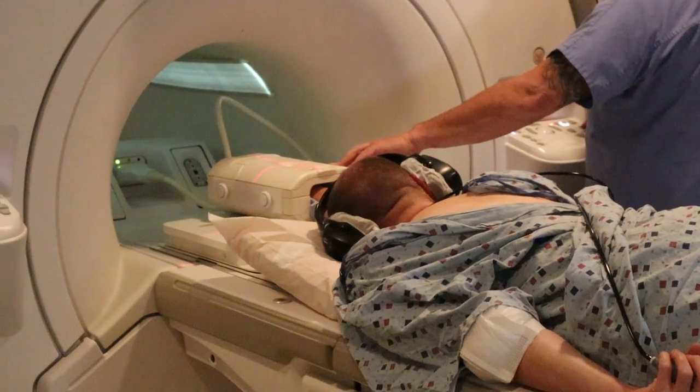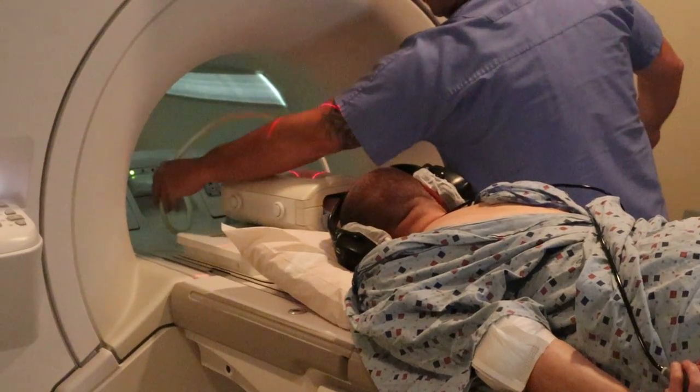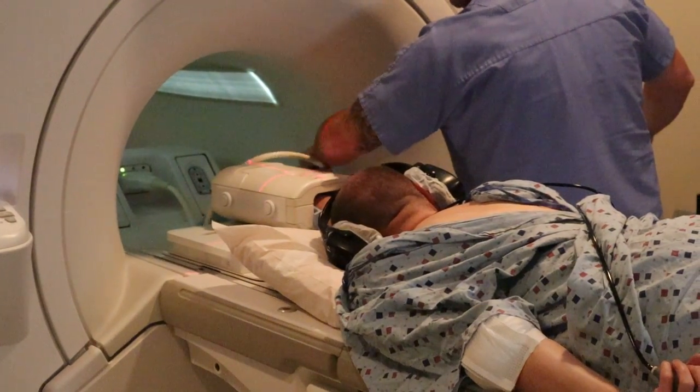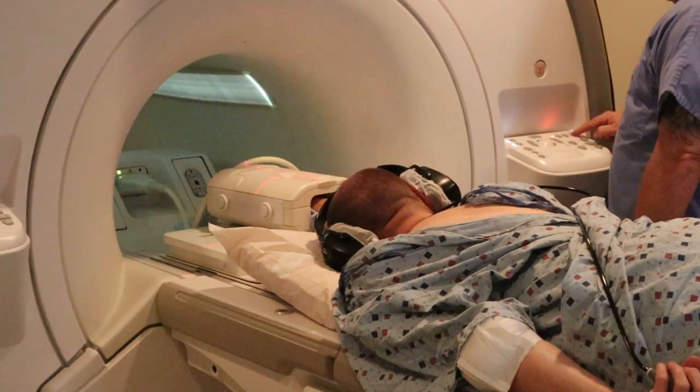You also want to make sure that your wires are not tangling. You want to ensure that they're nice and straight to reduce the chances of decoupling of the coil.